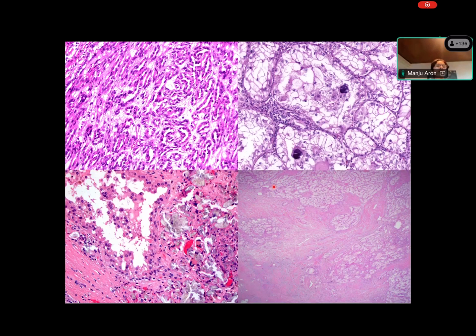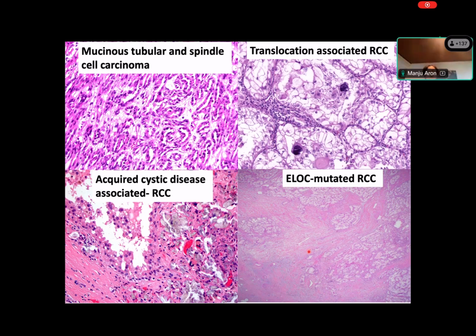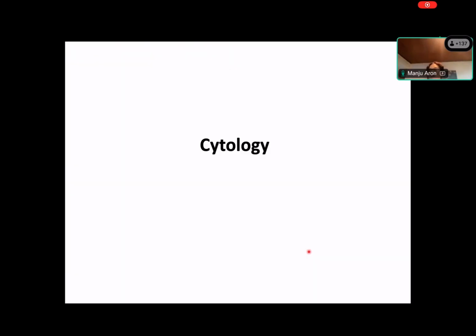And again, now we're looking at the background, and you can see here the presence of a mucinous background. Tumor is tubular and has a mucinous background. Here you can see the presence of psammoma bodies. Here you can see some crystals that you can identify. And this is again the presence of smooth muscle stroma in the background. And these are all the different kinds of tumors. So the evaluation of all these components is important.